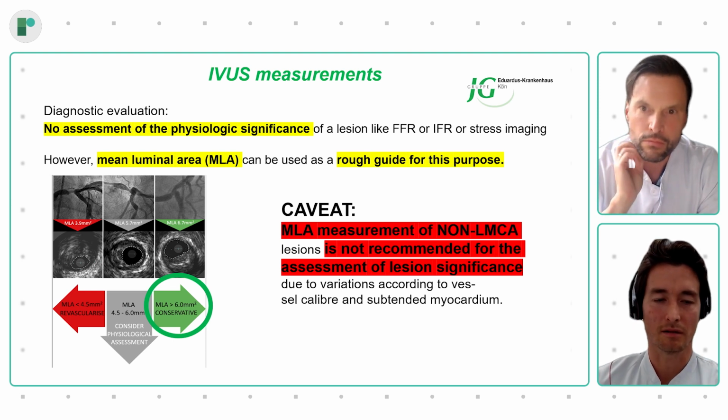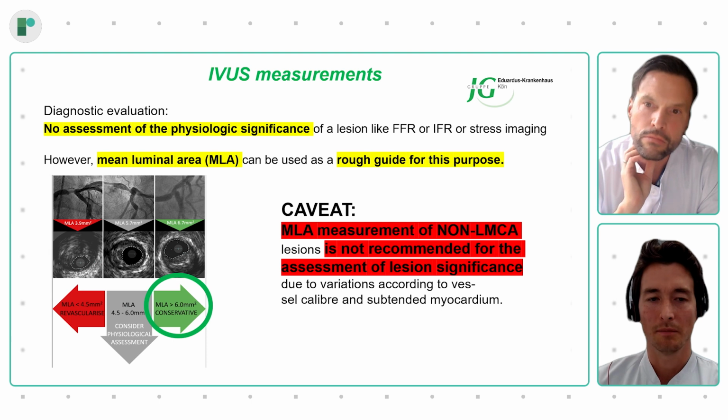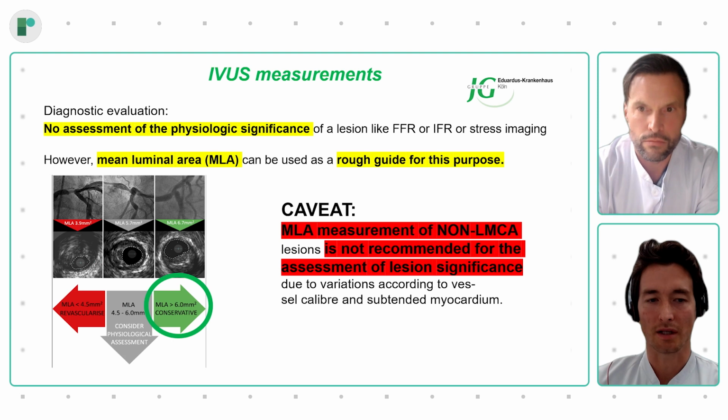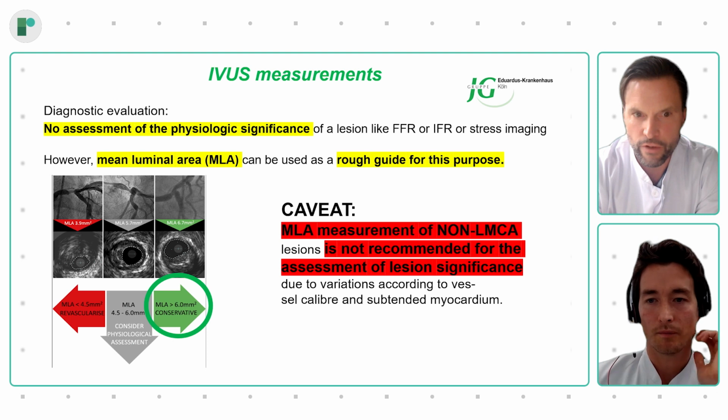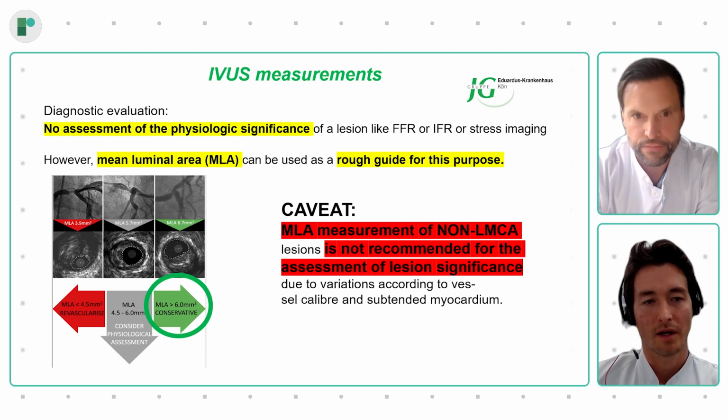Of course, it helps you understand your patient, but it also helps you to really tailor the treatment to your patient, and it does have an impact whether it's lipidic or fibrous, because it strongly makes a difference in choosing your landing zone, for example, the sizes of the balloon and the stent, as well as the plaque modification modalities that you can use. Especially plaque modification. Yeah, exactly.